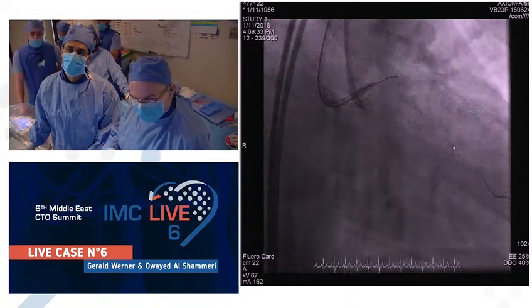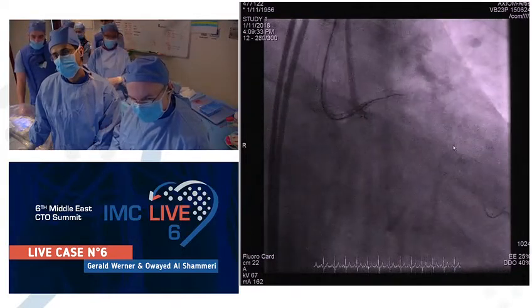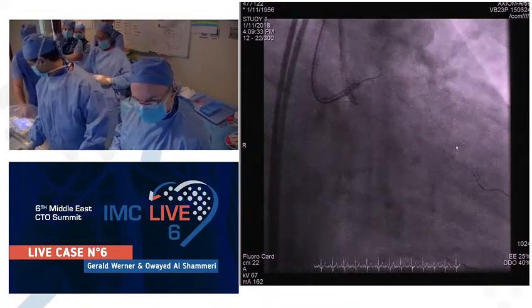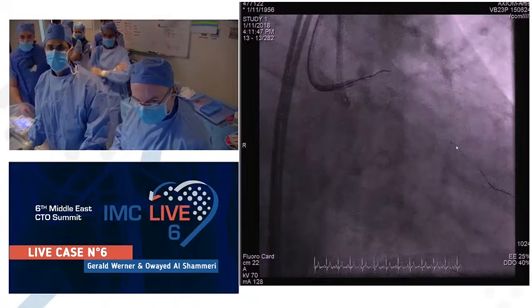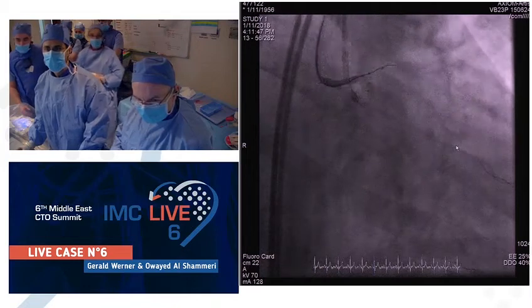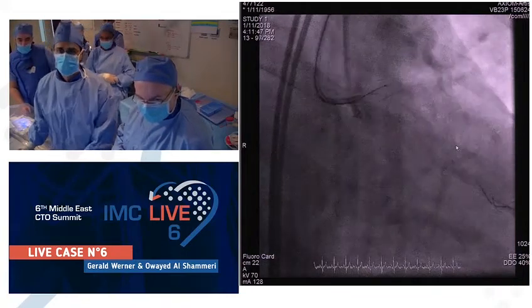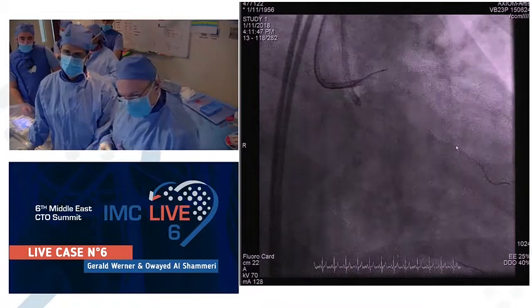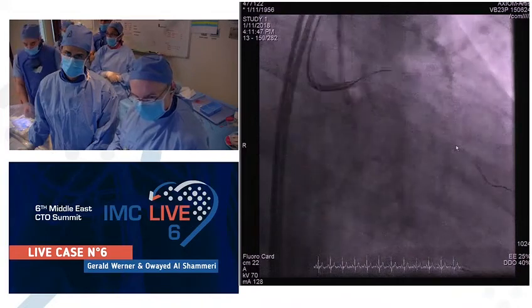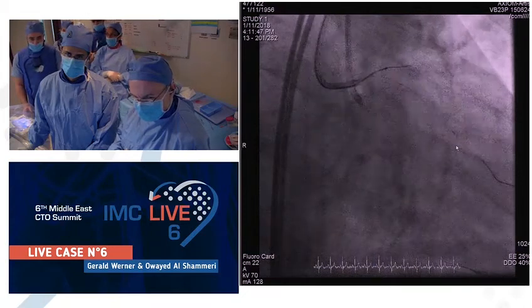Yeah, but you needed the tapering. The sound goes down. So you see the fluoro sequence here? Next. So we made progress. I could advance the fine cross a little bit. I just show you the fluoro sequences, one after the other. Now, I still work with a kind of damaged Gaia, but it seemed to work here. Until, wait, until it's at the end of the sequence.